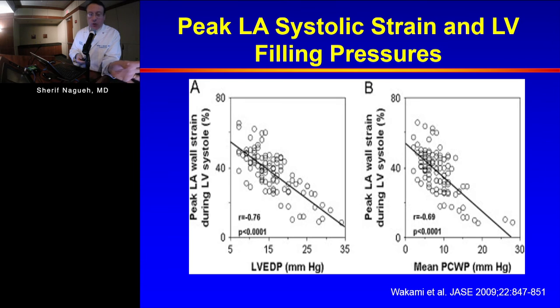These were patients, all comers to the cath, but did not really include patients with mitral valve disease, pericardial disease, bundle branch block, the other variables. If you were to think about LA strain, certainly it circumvents all of these variables I talked about, because the other variables primarily influence LV function as opposed to LA function, unless you're looking at patients with, say, pericardial disease adhesions that involve the atrium.